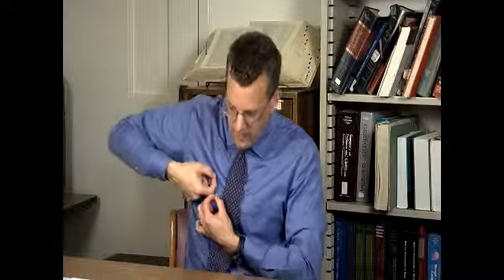Typically, if you picture the back wall of the heart, like if you're looking at me, there's 2 veins that come in on the back wall on the right side and 2 veins that come back on the left side. And sometimes we do these en bloc, so we go actually around both veins in one giant circle.